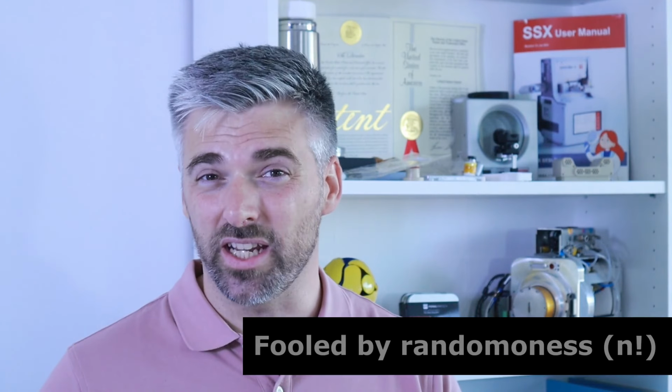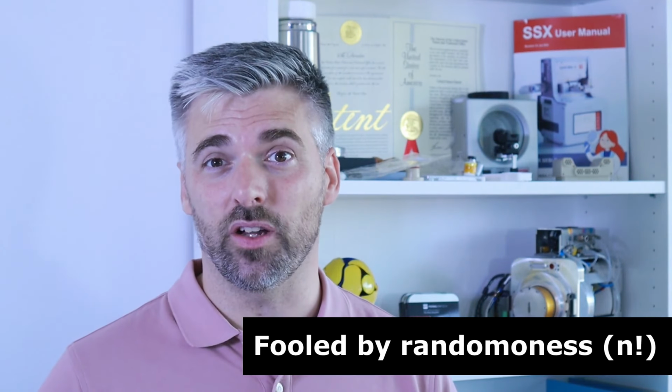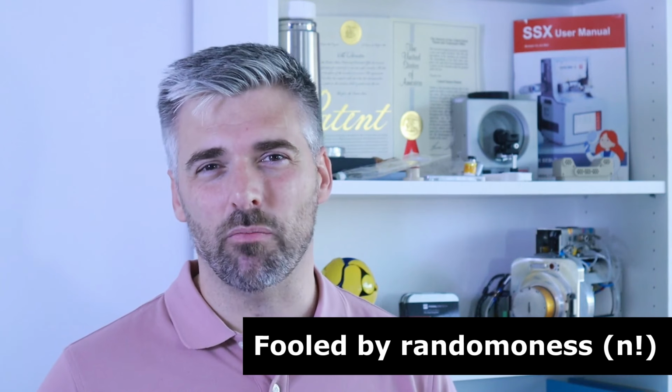And if you use combinations of signals, so-called fingerprinting, the statistical problem becomes huge. If 8,000 sounds like a large number, combinatorial numbers are a lot larger, way larger. They have factorials in them, and they explode rapidly even with very few signals. It becomes like a casino, but betting on all possible combinations. Here's the paradox. The better your instrument, the more likely you are to be fooled by randomness.